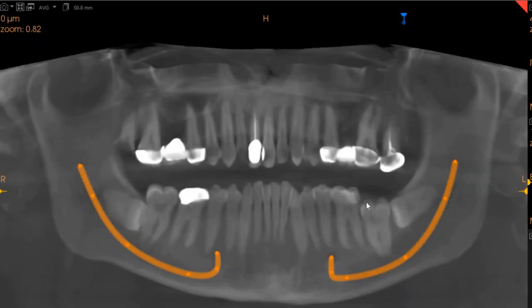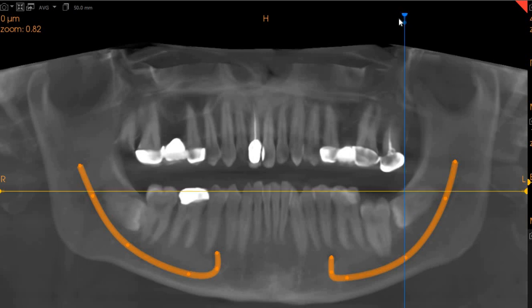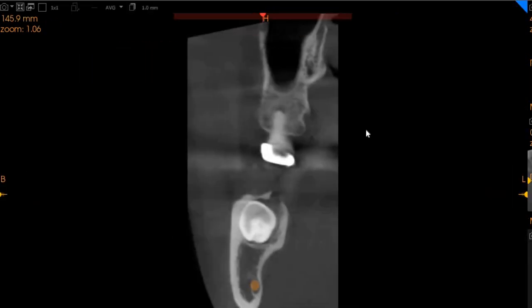As you can see on this panoramic view, the lower left wisdom tooth is impacted horizontally quite deep into the ramus of the mandible, but it is significantly far away from the inferior alveolar nerve.